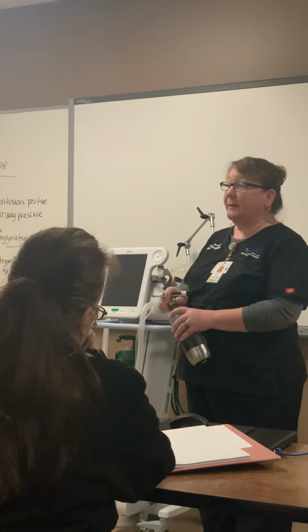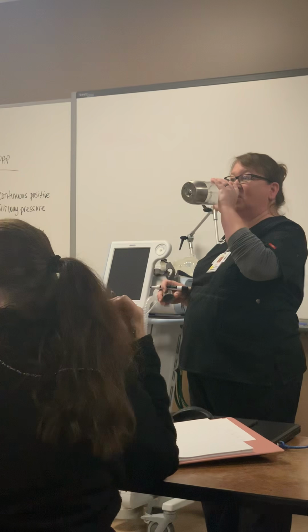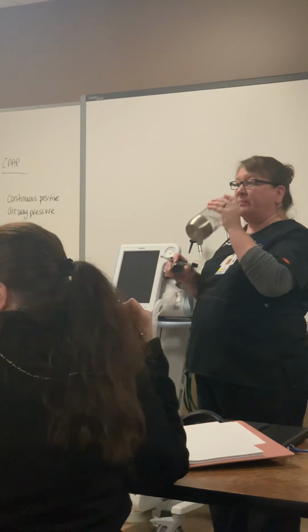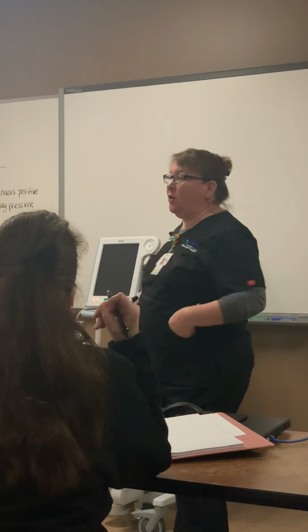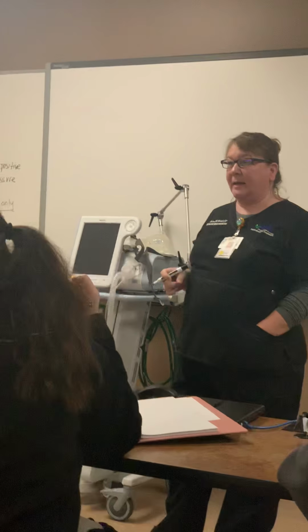That's a no. But being restrained, there's another thing: if he needs to take it off and the person that's watching him doesn't know they need to take it off, like, oh, I'm going to throw up. Oh no, keep it on, keep it on. He's restrained. No, the people in the room are told what to do. That's the whole point of them being there. So I don't know, Sharon. What's your experience with that?